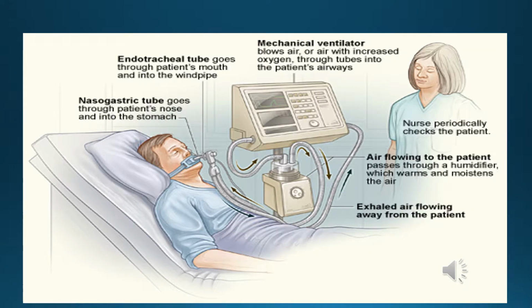This is what a typical patient in ICU looks like. You have your mechanical ventilator, your heated humidifier below that, inspiratory and expiratory limbs going to the patient's endotracheal tube. The endotracheal tube goes into the airway to ventilate the lungs with the volume of air. It's cuffed at the end so that whatever volume you desire to give that you plug into the ventilator actually goes into the lungs so you can control the respiration.